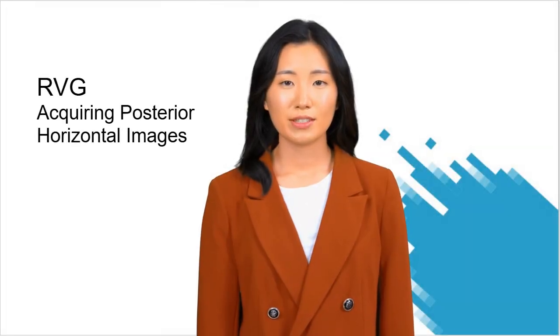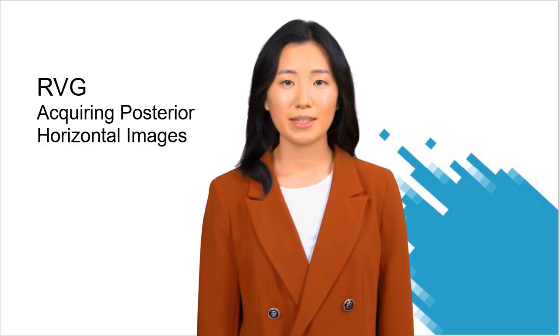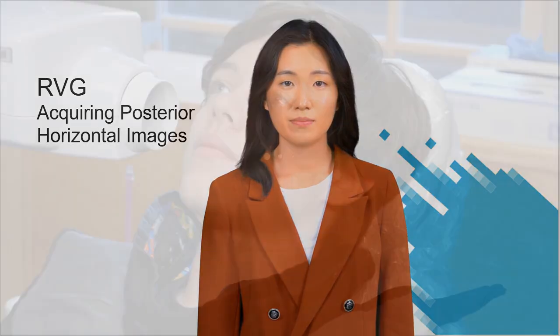Welcome to RVG System, Acquiring Posterior Horizontal Images. This recorded class is intended for clinical team members and provides guidance on capturing horizontal posterior images using the RVG system. By the end of the session, you'll be able to position the sensor to acquire both maxillary and mandibular posterior images in a horizontal configuration. The positioning technique remains consistent regardless of the sensor size.